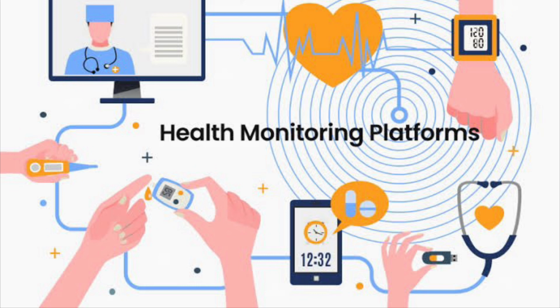Now, the merit of having continuous vital signs monitoring is naturally that the nurse need not go frequently into the room. It can be monitored. There is a feeling that the patient is being monitored continuously. Many times that can lead to a false sense of assurance that everything is perfectly fine. So that is why having a command center to very accurately monitor the data, go through the false alarms and address the correct alarms, is needed. Only then does this wearable continuous monitoring technology, whether for continuous inpatient monitoring in the hospital setting or for remote monitoring in a care home, a residence or the patient's home, become useful in clinical practice.